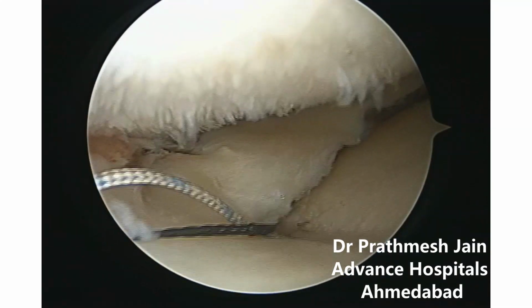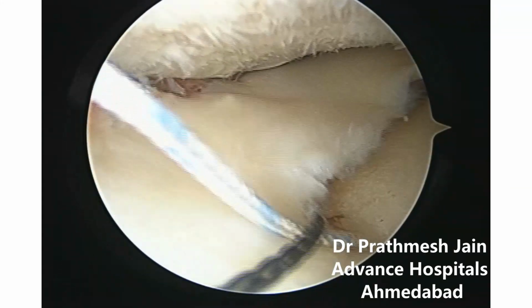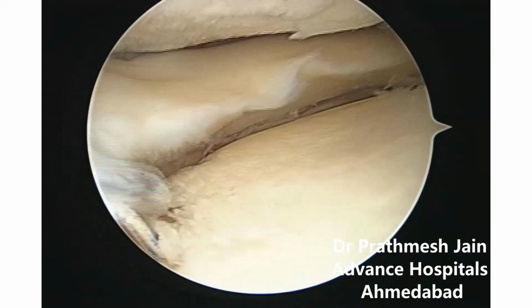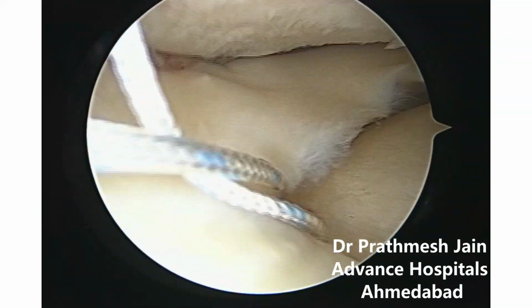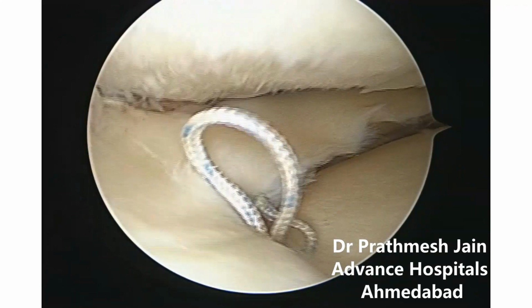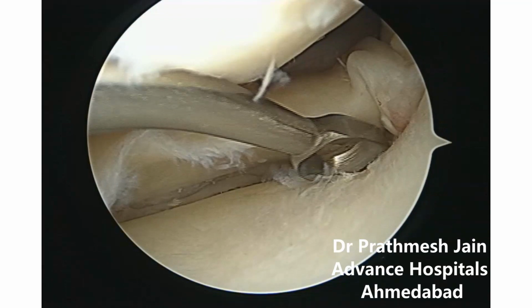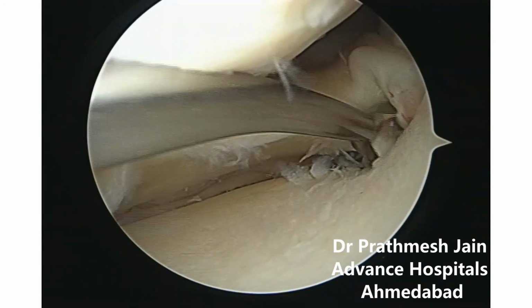So here we can see that both of the sutures are now shuttled through the meniscocapsular junction, and once both of the sutures are passed through the meniscocapsular junction, we can now focus our attention on the posterior aspect, that is the root itself. The root repair is done in a standard fashion.